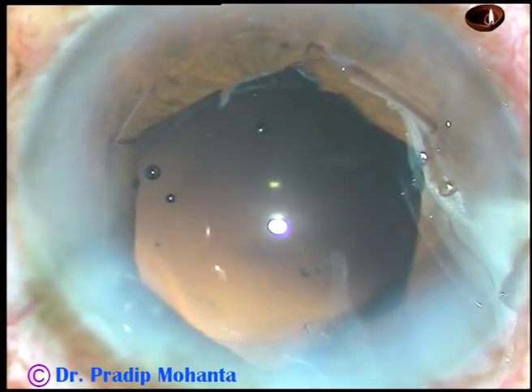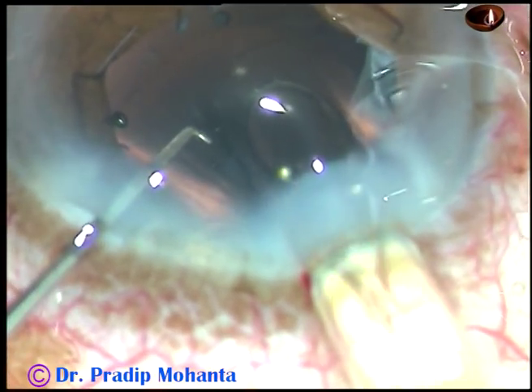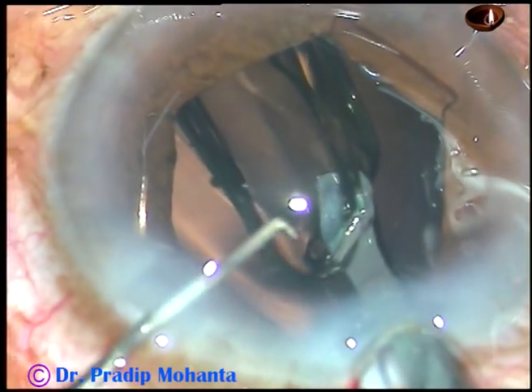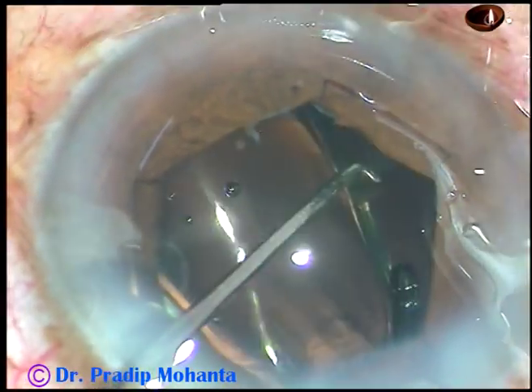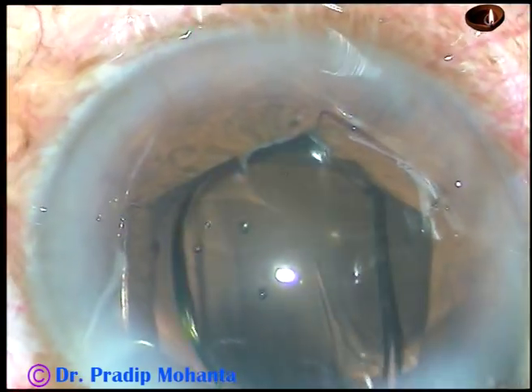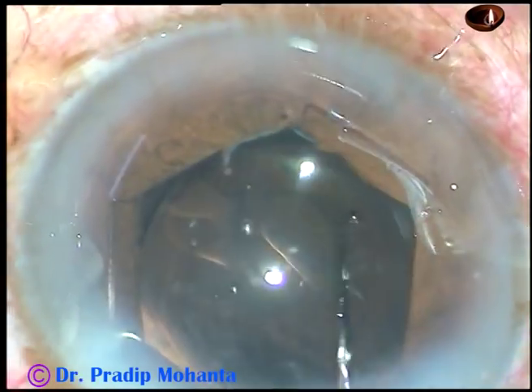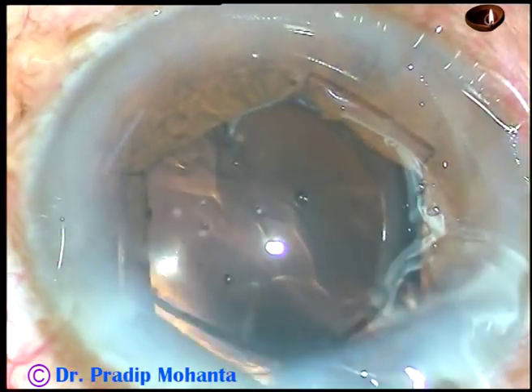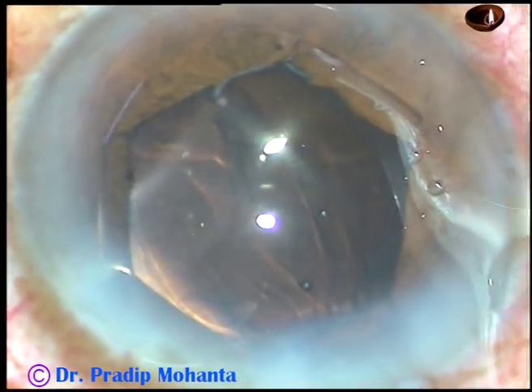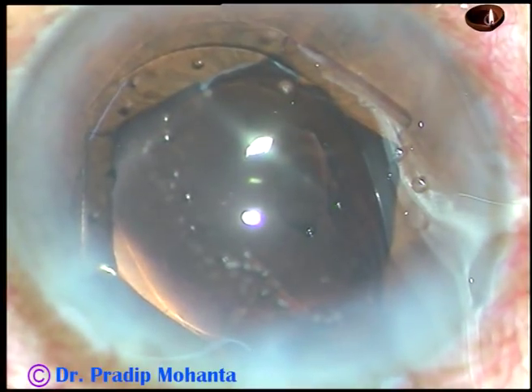Now cortical cleanup is done, and the anterior chamber and capsular bag are filled with visco. This is a hydrophobic acrylic single-piece monofocal intraocular lens being implanted in the capsular bag. The lens is dialed such that the haptics are about 90 degrees away from the main incision because if the haptics are away from the main incision, it is easier to go behind the IOL and clean the visco from the capsular bag.